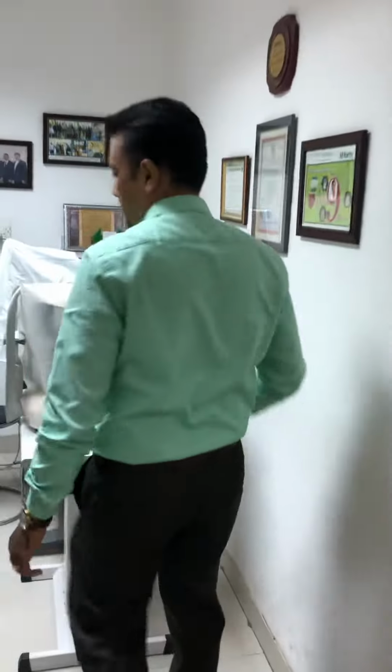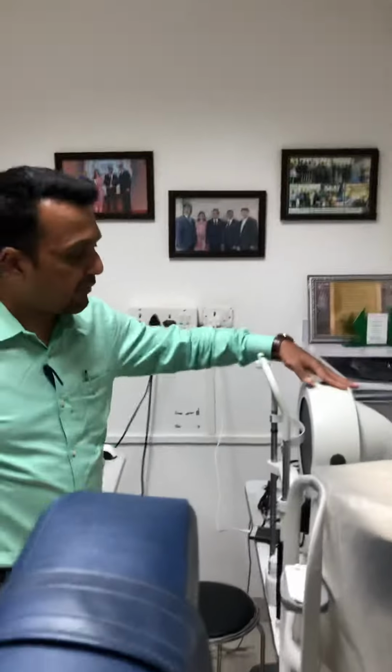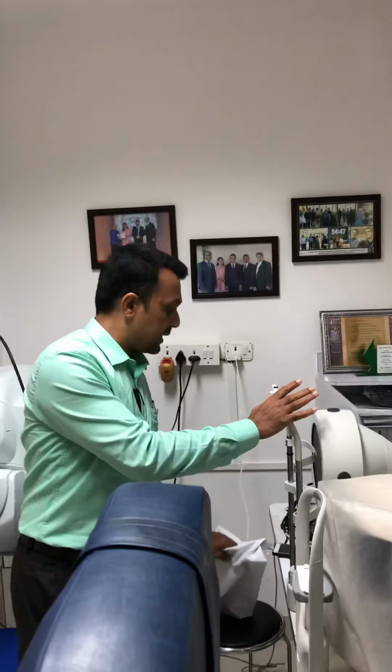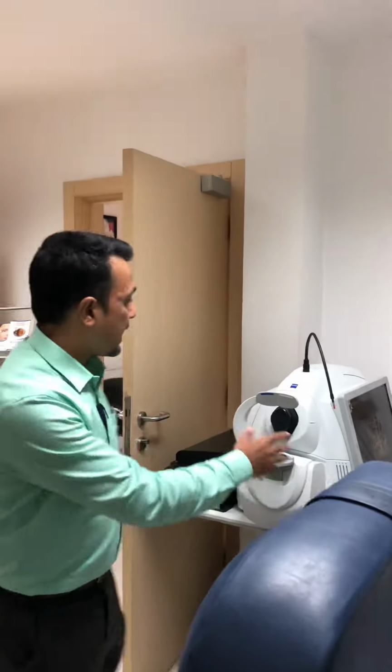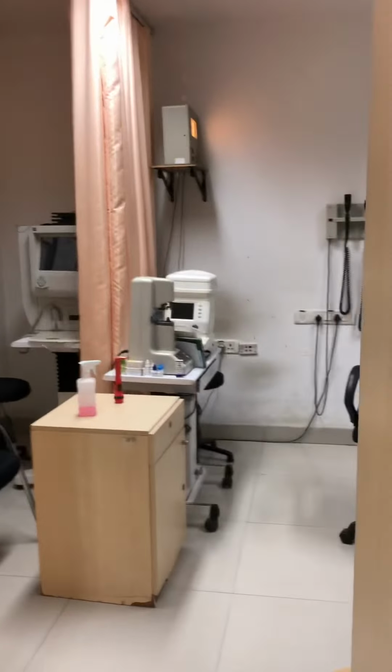We have other machines also which we use to check various things before we do the laser procedure. So this is the pentacam machine here, which is used to do the topography test. By doing the topography test, we know if the patient's eyes are safe for doing the laser procedure, while there are other machines: this one checks the retina, and the other ones over there check the glass power of the patient. So now let's come to the principle of this procedure.